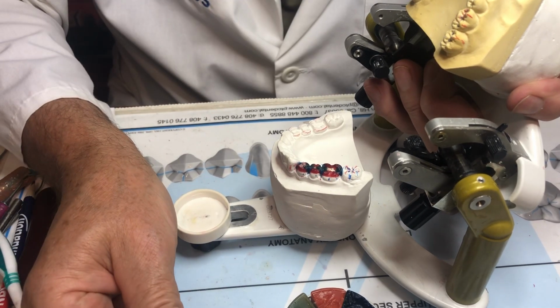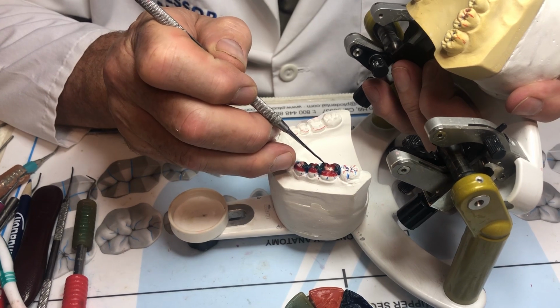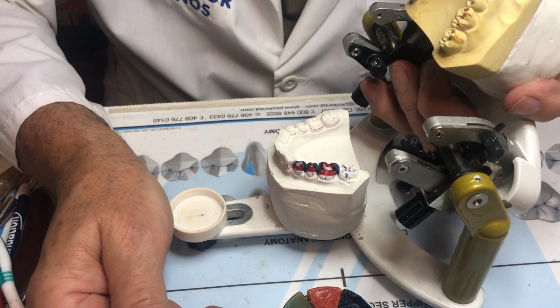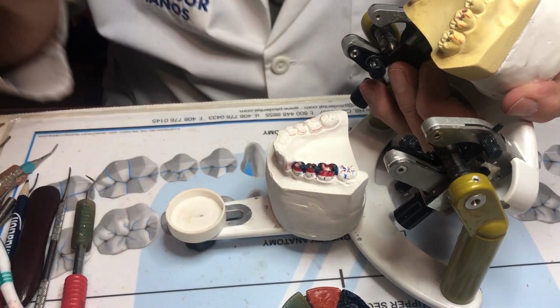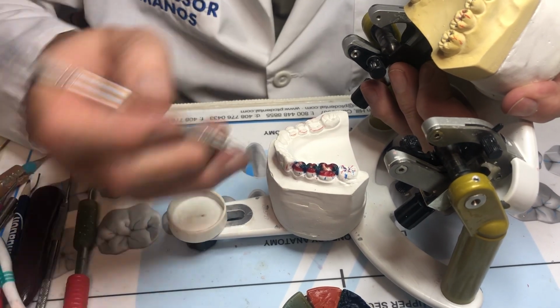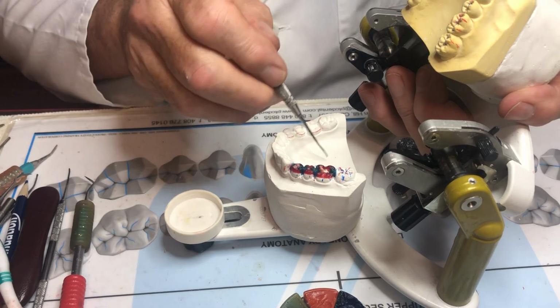So I'm just going to do one cusp for the video, but once you get the hang of this, you'll be able to do all of them. And again, if you don't like it, just rip it out. Don't try to fix it. Take a hot instrument, cut it out, do it over correctly. You may do it a few times. You can even practice on the base of the model right here.